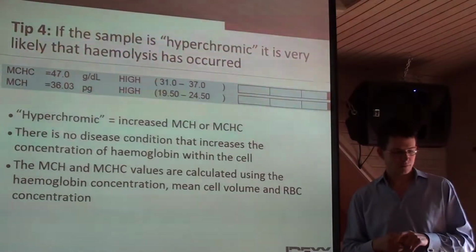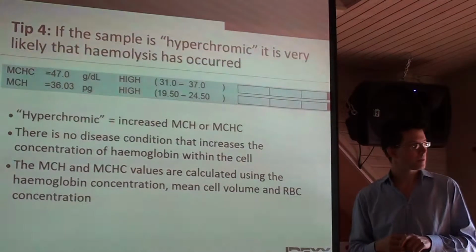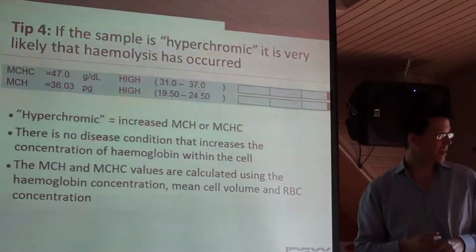And then it will divide the hemoglobin by the red cells that it has found.